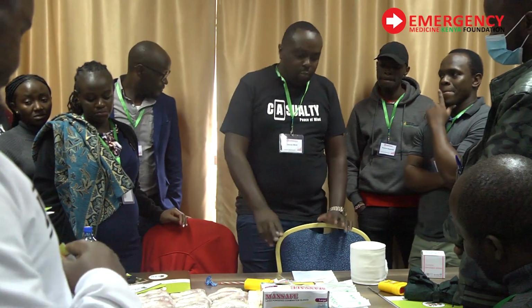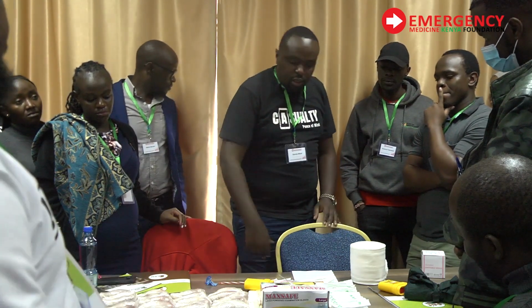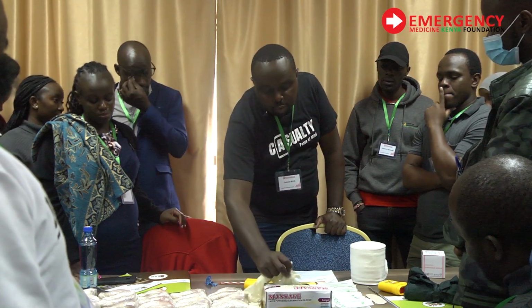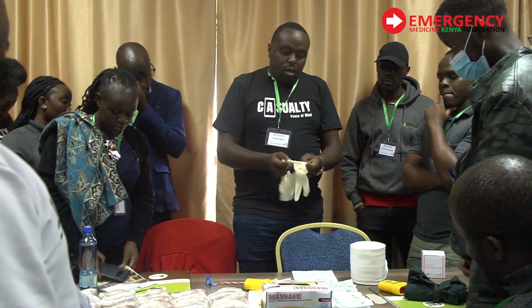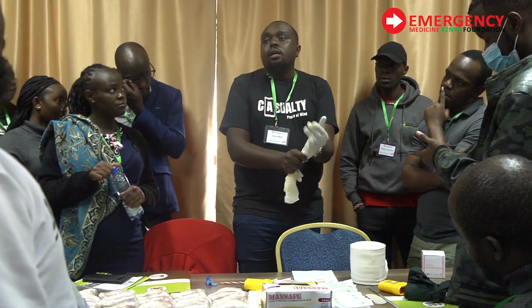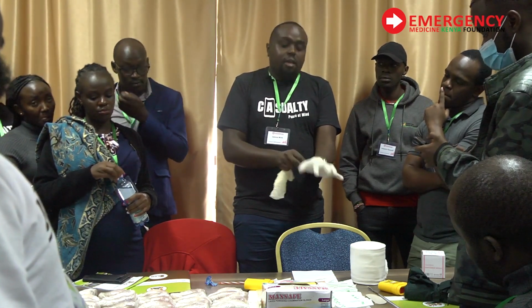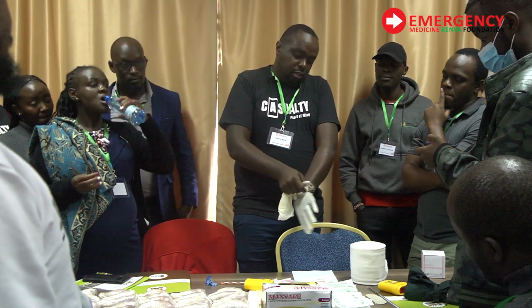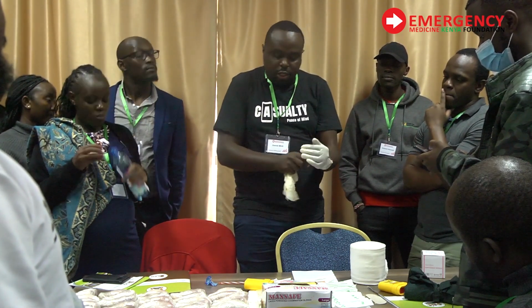So once you have prepared your items, I'm going to demonstrate, and each one of you will pick a sample. For purposes of this, we are going to use chicken thighs. I don't know if chickens have a femur, but we'll presume that this is the femur part of the chicken.